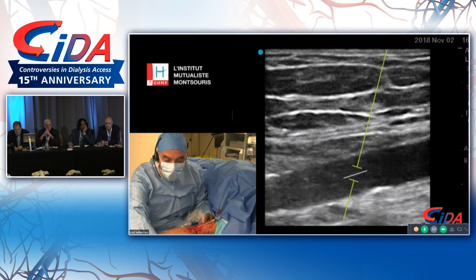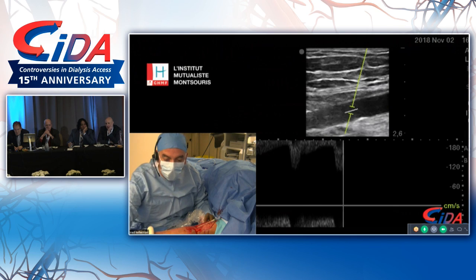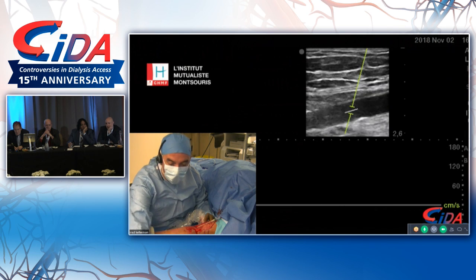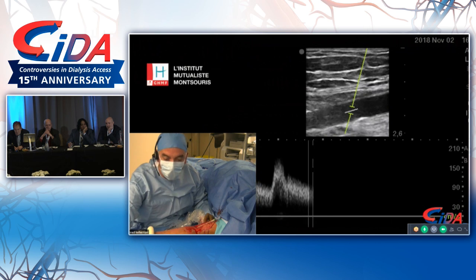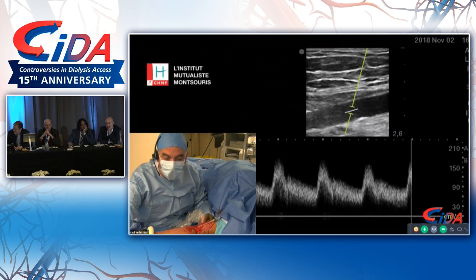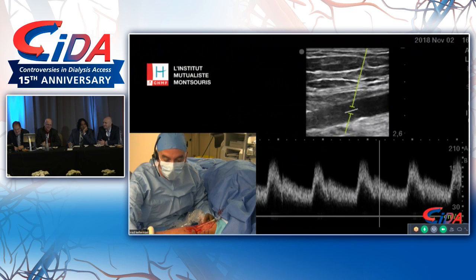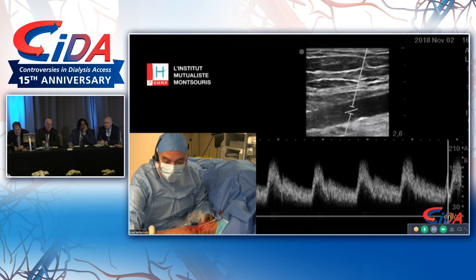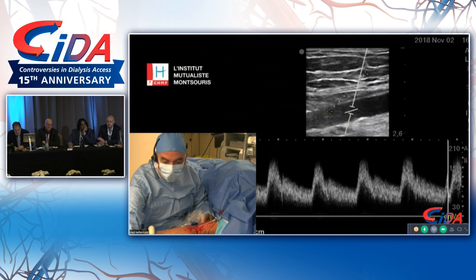So what we do here for all our cases, we give axillary block, and we give also some sedation. Especially when you do a live case, you don't want to have the patient start singing. But generally, we try to give them some sedation, and they all get axillary block. And to be honest, the axillary block is more for the vasodilation and less for the actual pain, because the truth is that for the pain, you can easily do it with local anesthesia, no doubt about it.